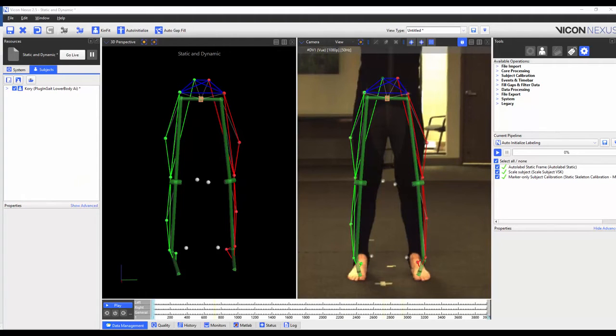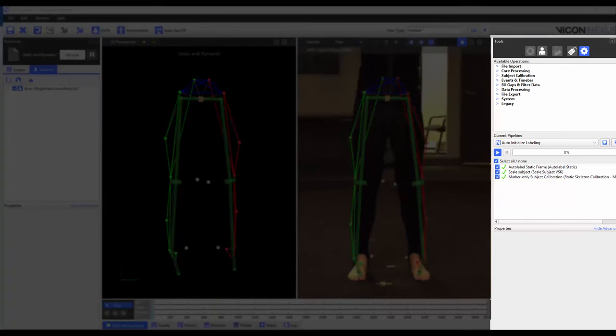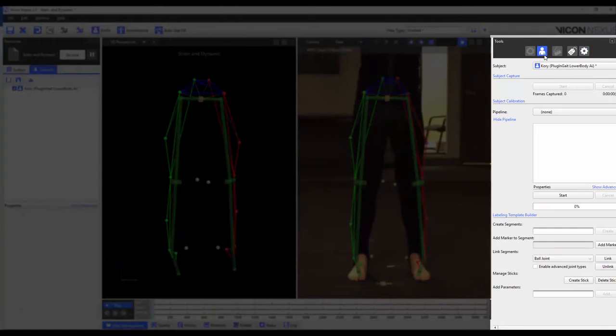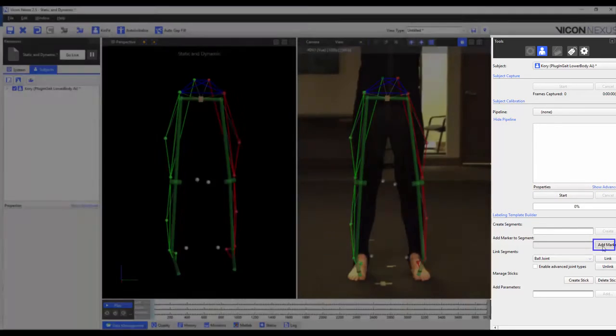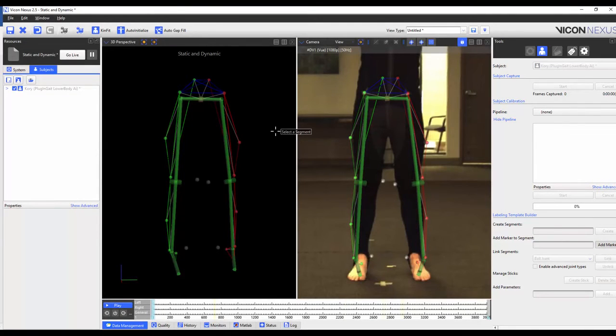Now that we've calibrated the VSK we're ready to add markers. To do so I'm going to go to the tools pane subject prep tab and click on add marker. This then prompts us to choose the segment.